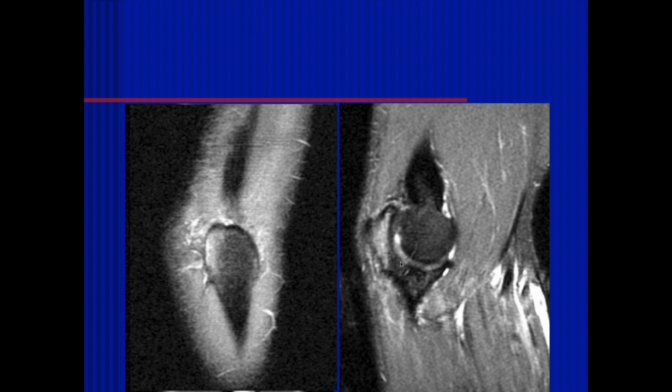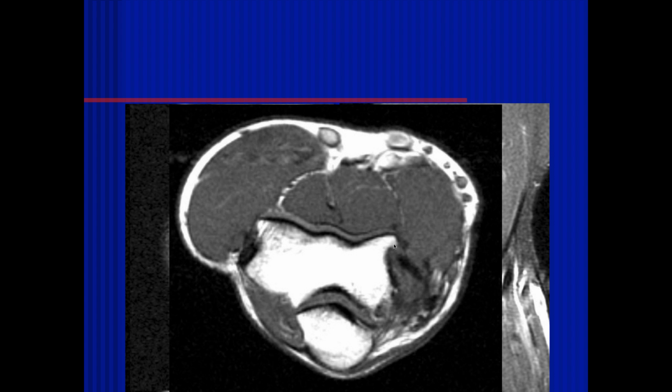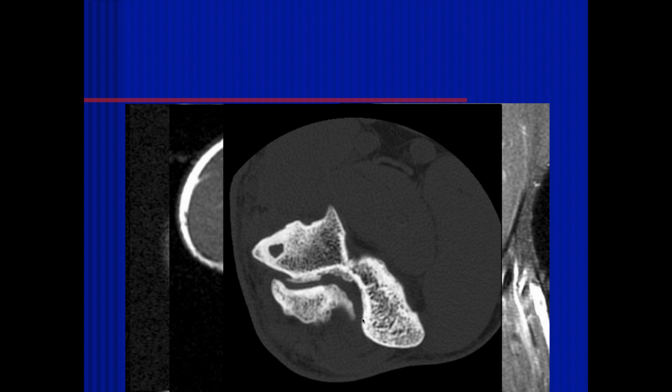But the other thing that often occurs here, you also need to look at the posterior medial aspect of the elbow and the olecranon and the articular cartilage back here, which we can see edema within the olecranon in this location. And if we go to the axial images, what you'll often see in the posterior medial compartment is a lot of degenerative change, wearing and chondromalacia back here. And this is part of posterior impingement.